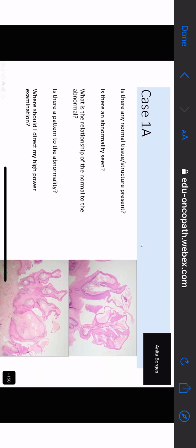Do you know that we ask these 5 questions? I don't know if you ask these 5 questions, but I do to myself. So it makes my description easier. And I think, Dia, you can answer these questions. And these are the 5 questions I always ask myself at low power.